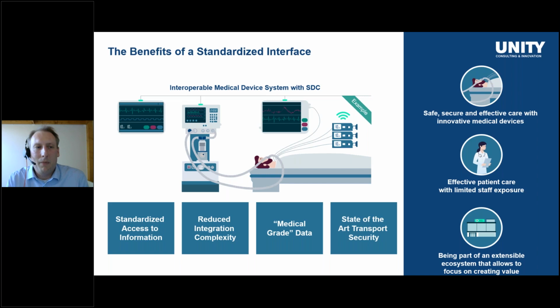It also makes use of the qualification of the data within the SDC network or in the protocol, where you can decide if this is medical grade data or if it's more data for documentation purposes only. This information is coming from the source device. What I didn't touch so far is the whole aspect of transport layer security, but SDC also uses state-of-the-art technology there. So from my perspective, the benefit for the patient is that they will get safe, secure, and effective care with innovative medical devices.